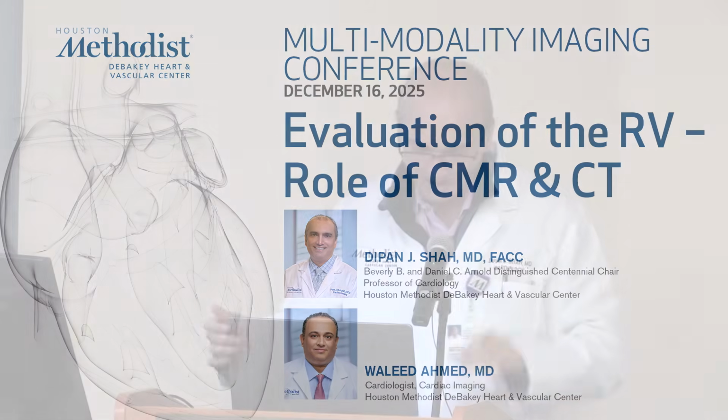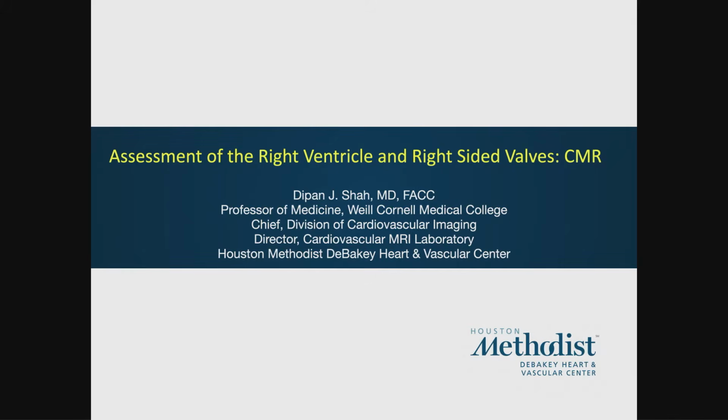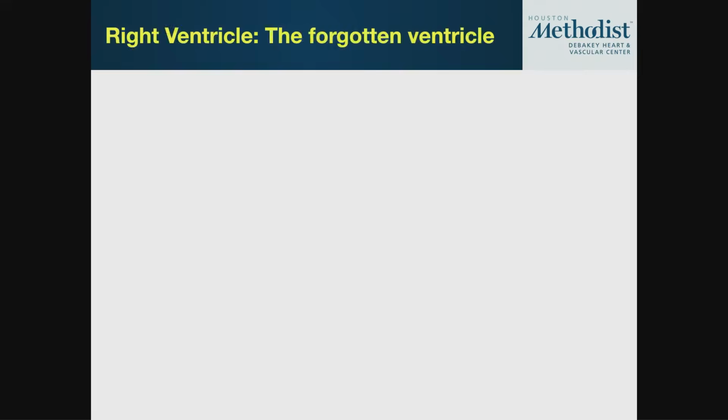So last week, Dr. Naga talked to us about echo assessment of the right ventricle. We're going to continue on with that theme, and today I'm going to talk about CMR assessment of the right ventricle, and Dr. Waleed Ahmed will talk about cardiac CT assessment of the right ventricle.